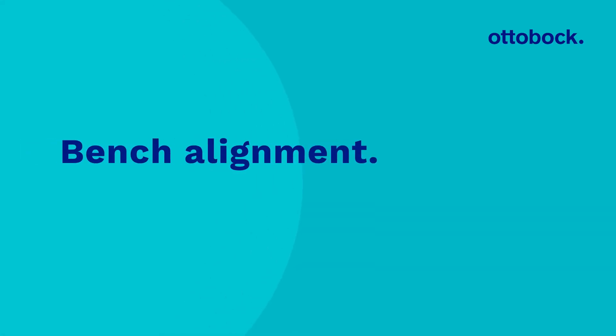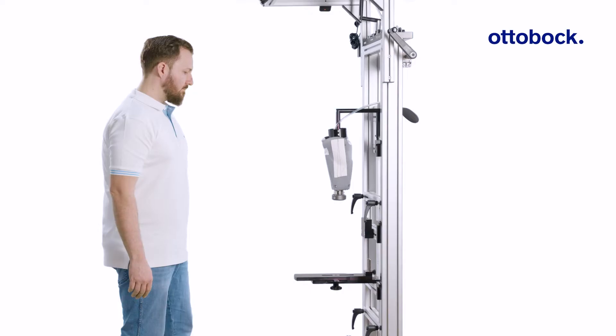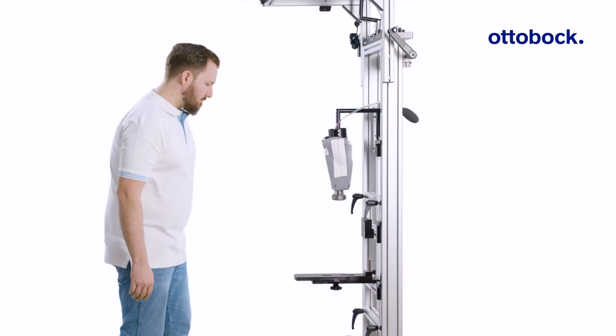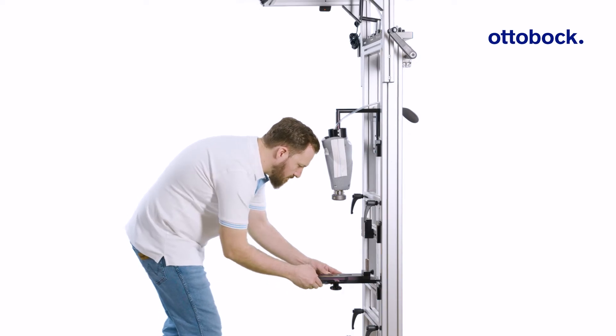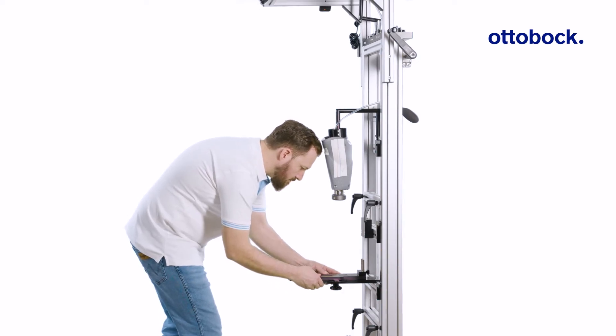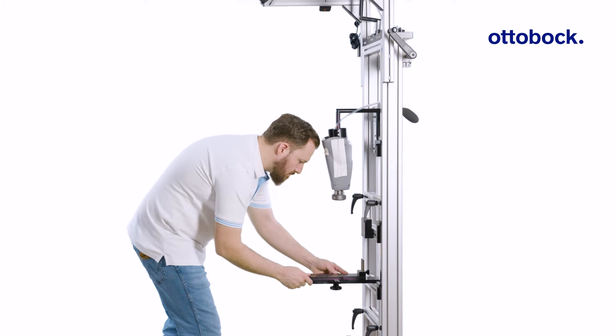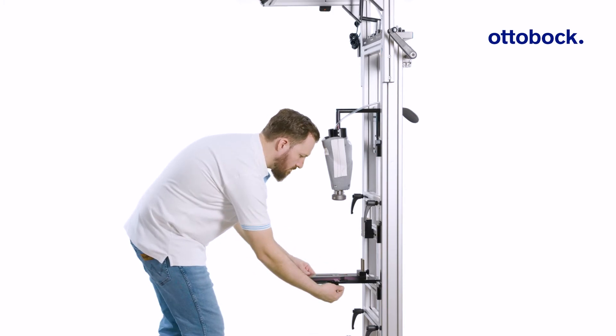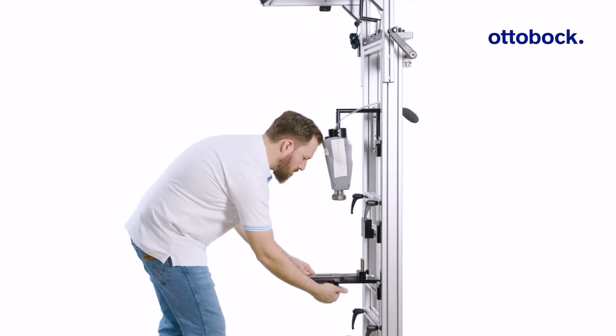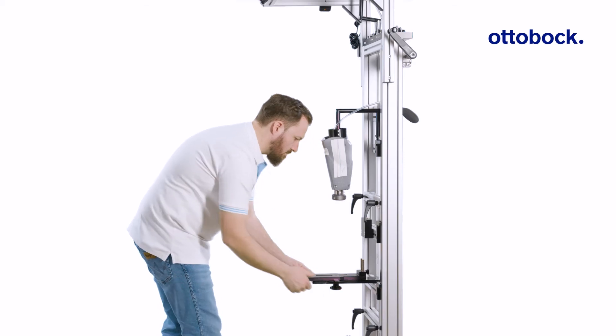For the bench alignment process, observe Ottobock's general alignment recommendations for transtibial and transfemoral prostheses. This video shows the specifics of aligning the Taleo ADAPT using the transtibial alignment recommendations and the Ottobock Proza assembly device. Adjust the plate for an external foot rotation of approximately 5 degrees.